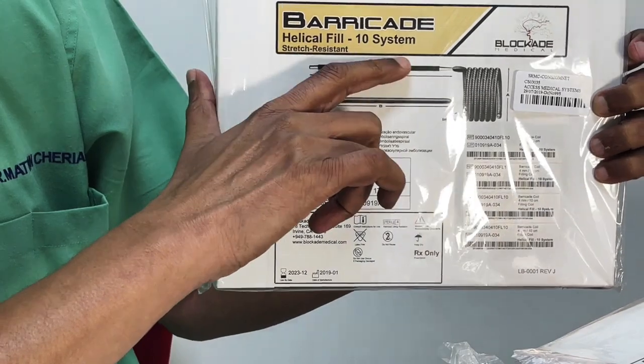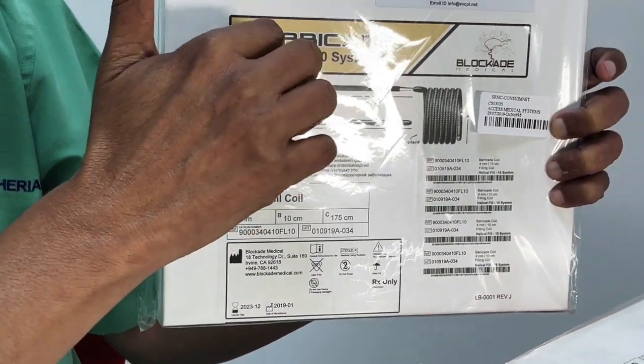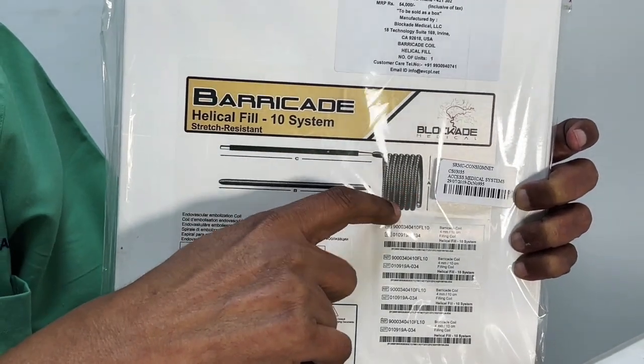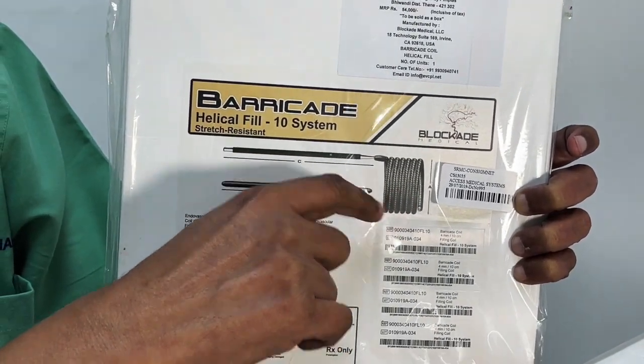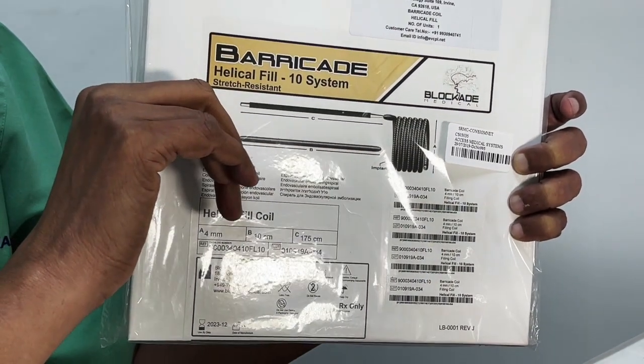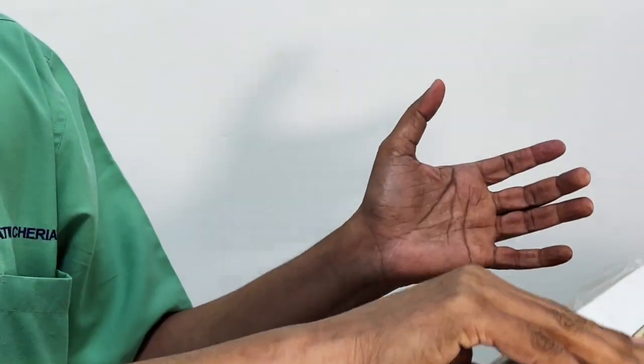It's a helical fill system, so equivalent to an ultrasoft coil. So basically, it's a filling coil. And what is it? It's helical. Why are they using helical? Helical works very, very well for filling, and it's always a good coil to complete or finish your procedure at the end, because it will find spaces and sneak into those places.